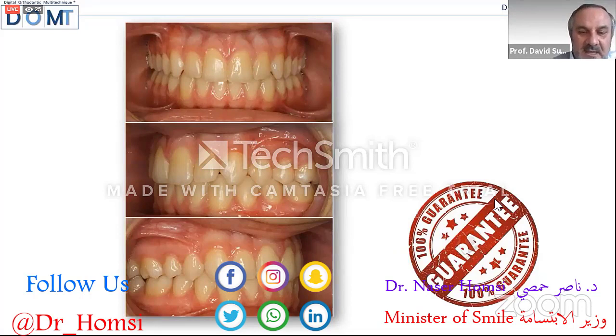Okay, in my office, I use a lot of functional appliance, and I don't have problems with the functional appliance. A lot of people talk about, I have a lot of problems with the kids because the kids don't use the appliances. It's not possible to put removable appliances in the kids, or it's not in my office. I have a good result, because the main problem in orthodontics today is how to move the mandible forward without functional appliances. Not because Forsus or another type of appliances like Forsus, they produce a dental-alveolar protrusion of the lower incisor.